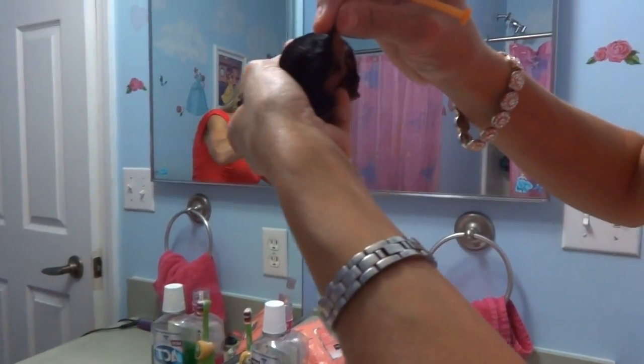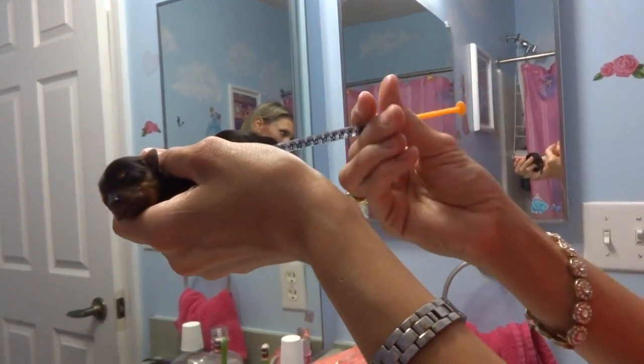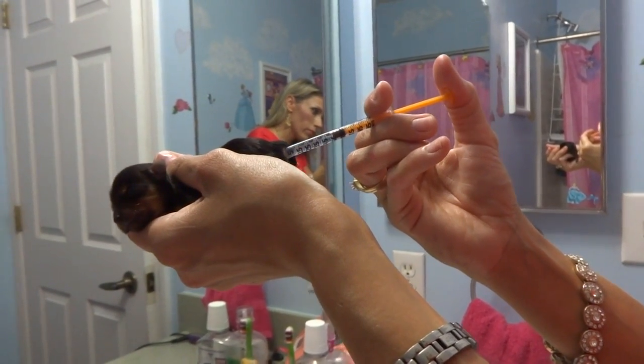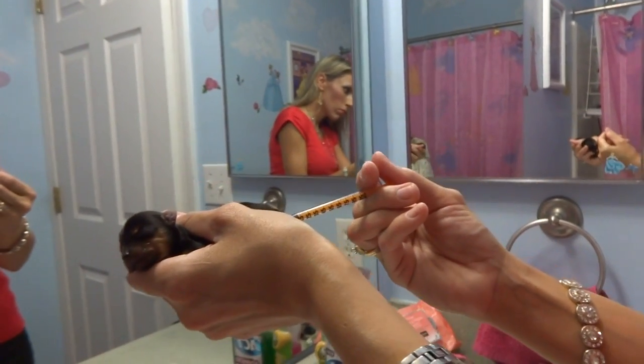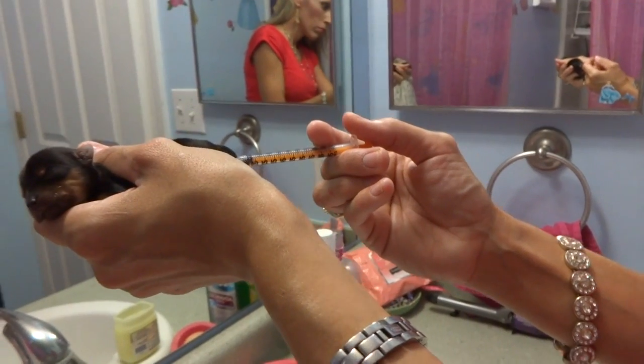I'm going to find her little rectum, hold the syringe up to there, and then push the fluid into her rectum. I'm going to hold it there for a second so it doesn't come shooting back out. There we go.